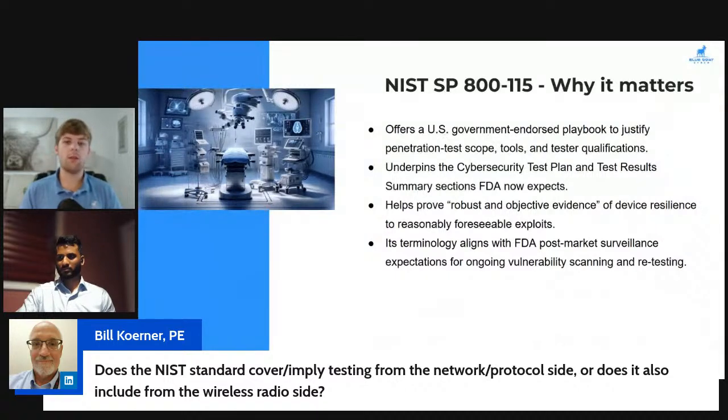The process should be reproduced across different technologies, while the specific test cases may vary. What it looks like from our perspective, since oftentimes with medical devices we're more looking at the Internet of Things, the wireless side, as opposed to the network testing side, is that we will identify whatever technologies are in place and then stem from there our threat modeling activities to say, what do we think can go wrong? We'll come up with a comprehensive threat model, a list of everything that we think can go wrong, develop test cases from each of these threats in the threat model, and verify them from the penetration test.